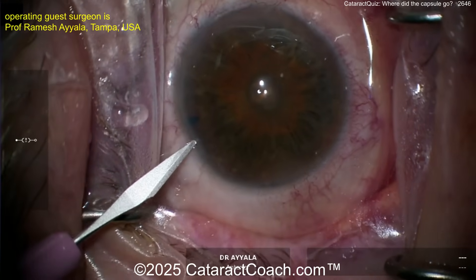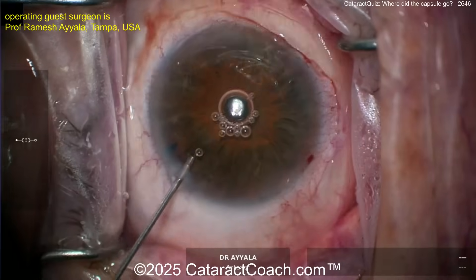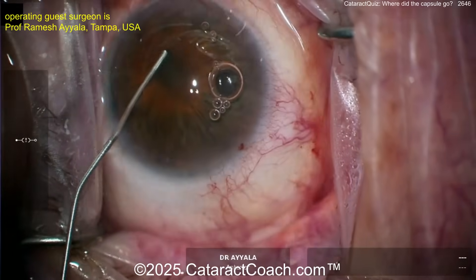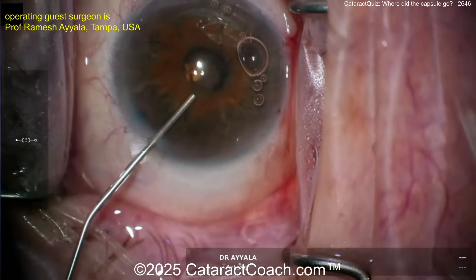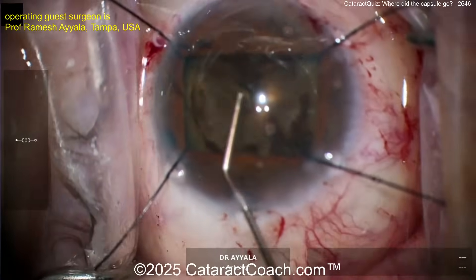Now you've got the patient dilated up. Let's take a look — looks like some sort of central opacity there. Get some viscoelastic in, maybe get the synechiae broken, get that eye dilated. There's the iris hooks.